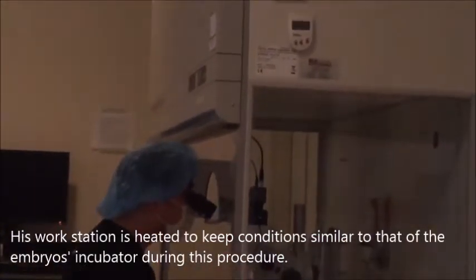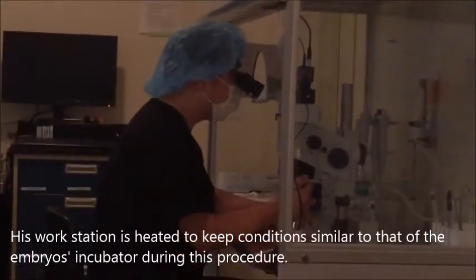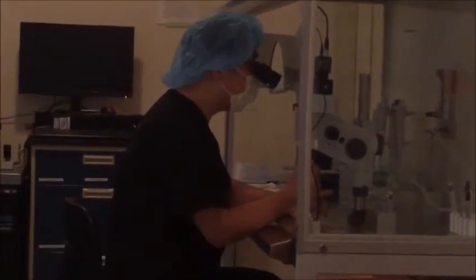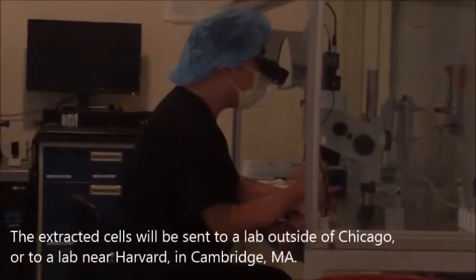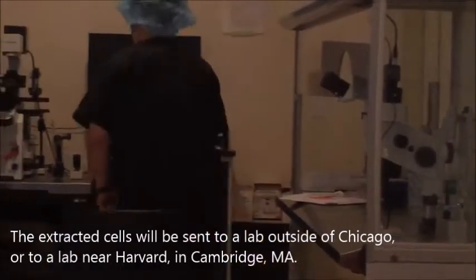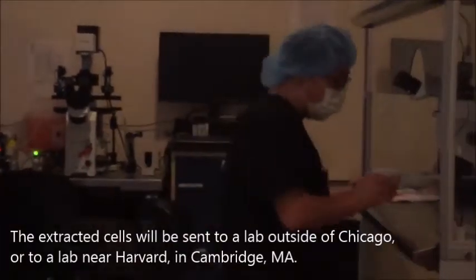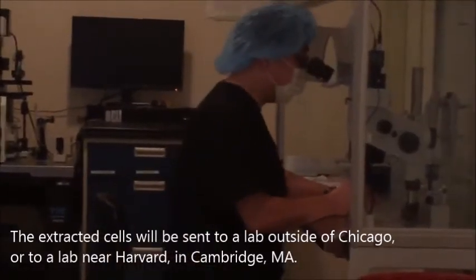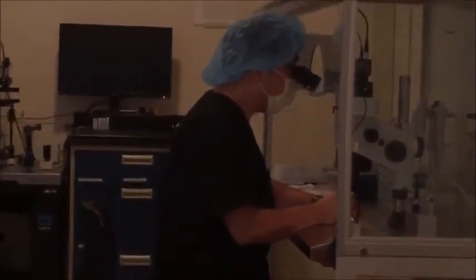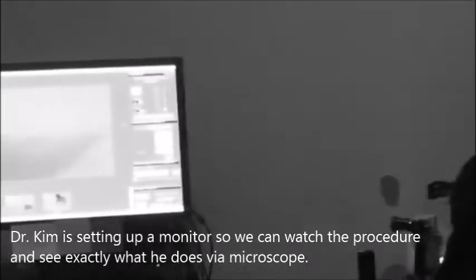As you can see, he's working on a heated stage with a hood to keep the conditions similar to what's in the incubator. He's moving the embryos from the media in the incubator and bringing them our way. Those blastomeres will then be sent to a laboratory — either one outside of Chicago or one affiliated with Harvard in Cambridge, Massachusetts.